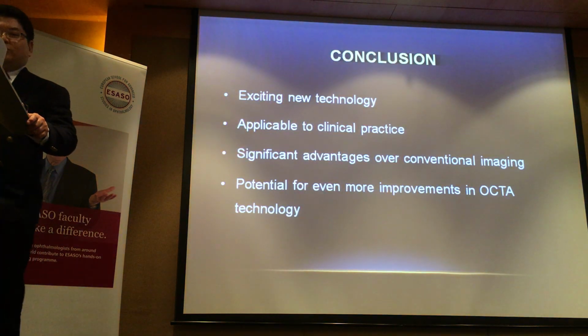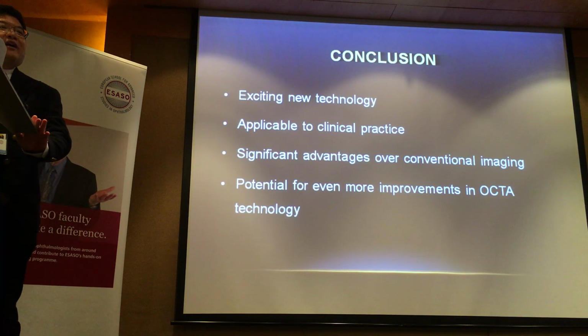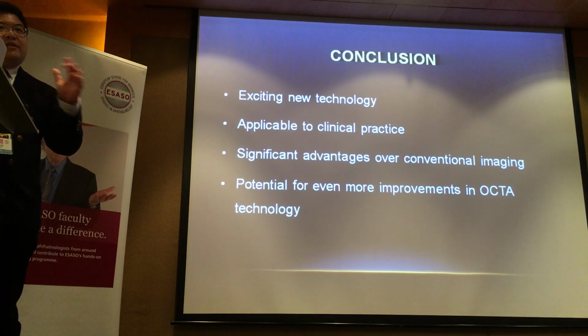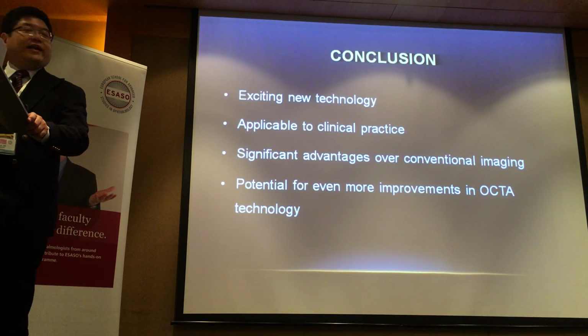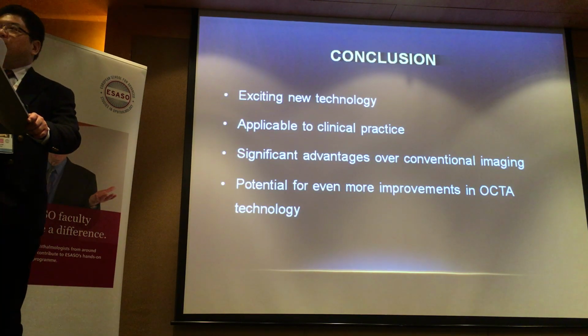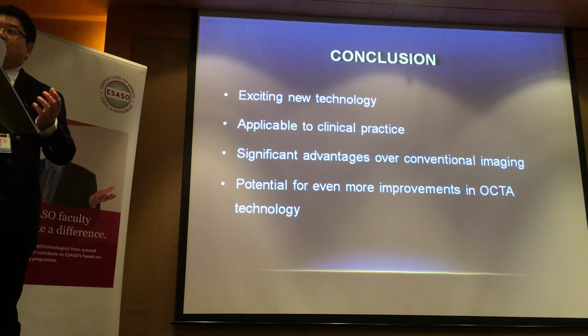Right, so to conclude, I say OCTA is an exciting new technology. It is here to stay. I'm convinced of that. I'm excited to have it. It can be applied to clinical practice, and it has advantages over conventional imaging. There's obviously great potential for even more improvements, but I would just urge everyone to be careful in interpreting it.